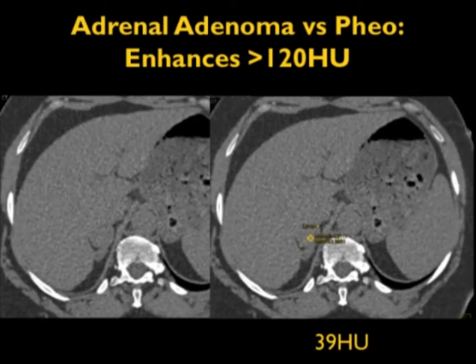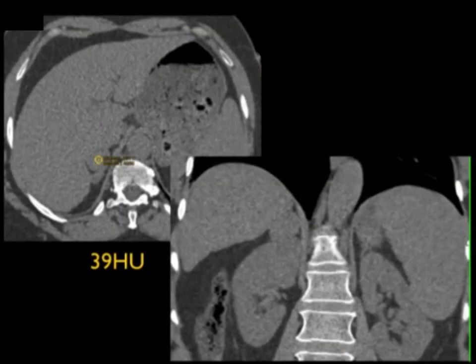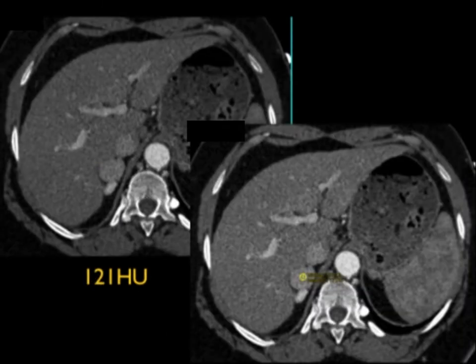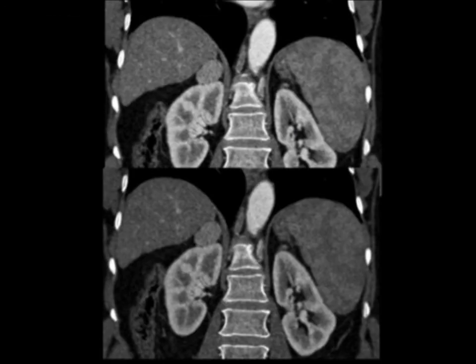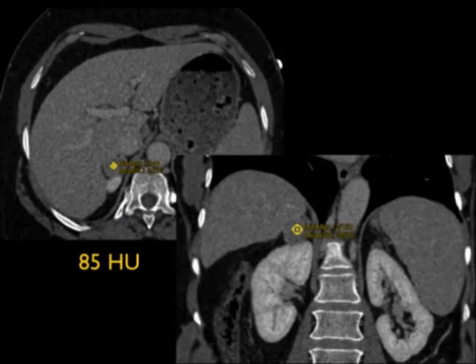A mass greater than 110 HU enhancing in arterial phase, particularly with higher enhancement in arterial, is most likely a pheo. Another example: a right adrenal lesion at 39 HU, well-defined and round, enhanced to 121 HU with IV contrast — above 110, even above 120. It's vascular, and while you could consider renal cell carcinoma metastasis, you must be thinking pheochromocytoma. This was resected and confirmed as an incidental pheochromocytoma. Even though it washed out 50%, when you're suspecting a pheo, washout values do not count.